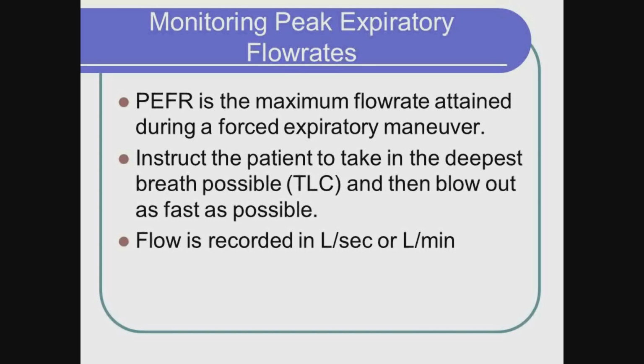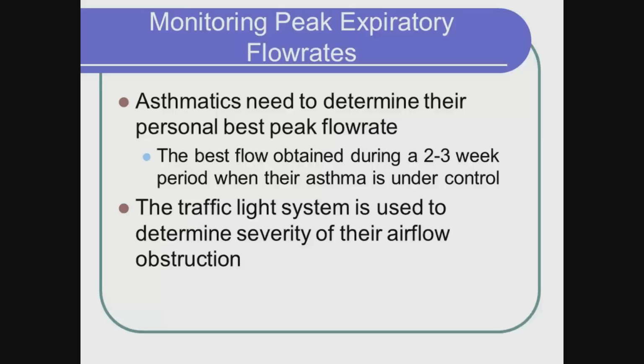So we're going to look at the maximum flow rate attained during that maneuver. And we do this by having them take a deep breath in to total lung capacity and blasting out as hard and as fast as they possibly can. And it's recorded either in liters per second, which is typically how a PFT lab would report it, or more commonly at the bedside with a handheld meter, it's typically in liters per minute.